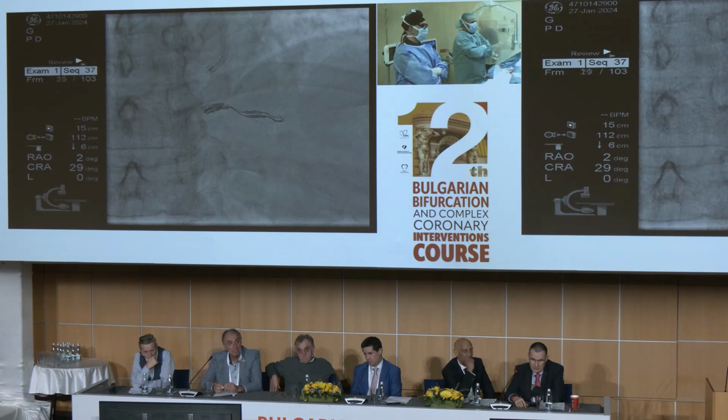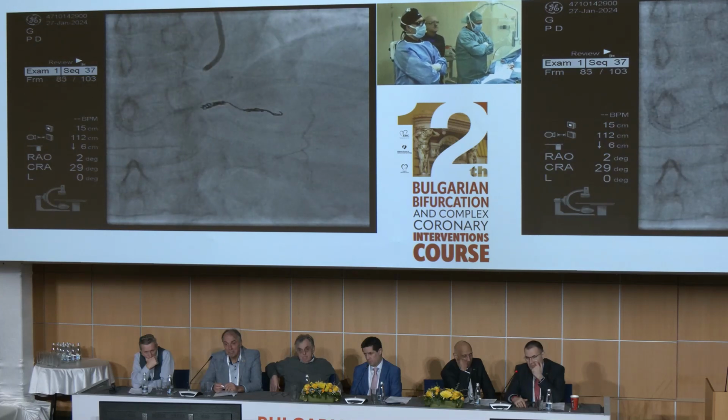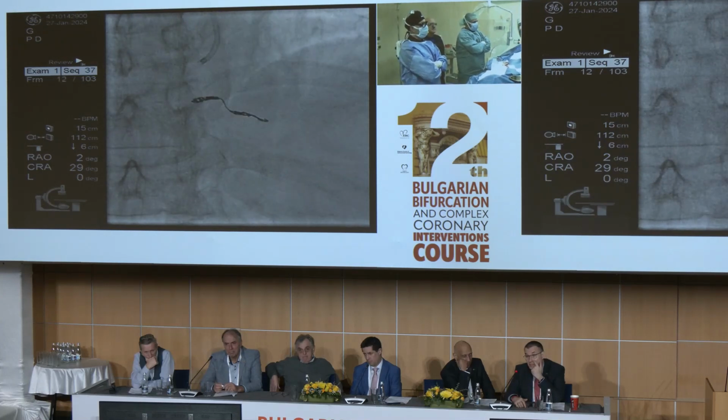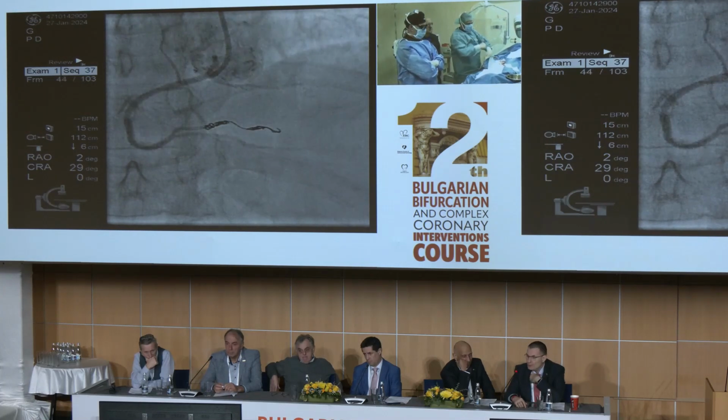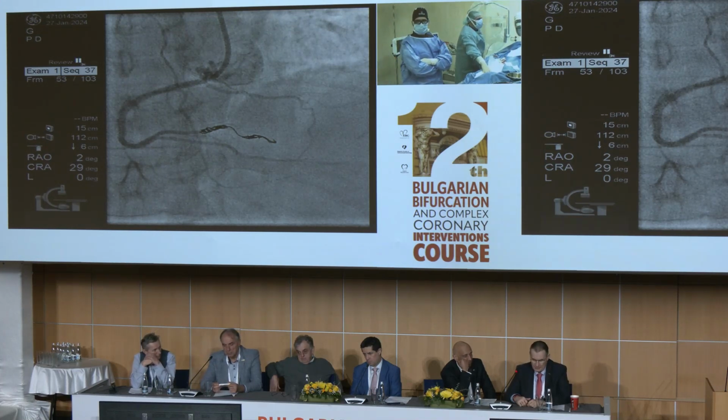My personal strategy in our cath lab is just to go as distal as possible with an Export catheter and to inject gel foam. We previously tried to inject gel foam through the microcatheter, but it is not good. But with, for example, the Export catheter, this is very easy and effective.